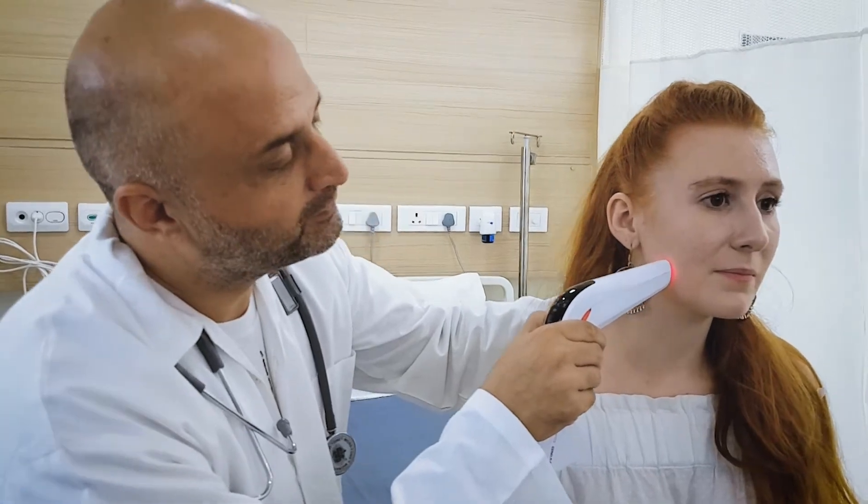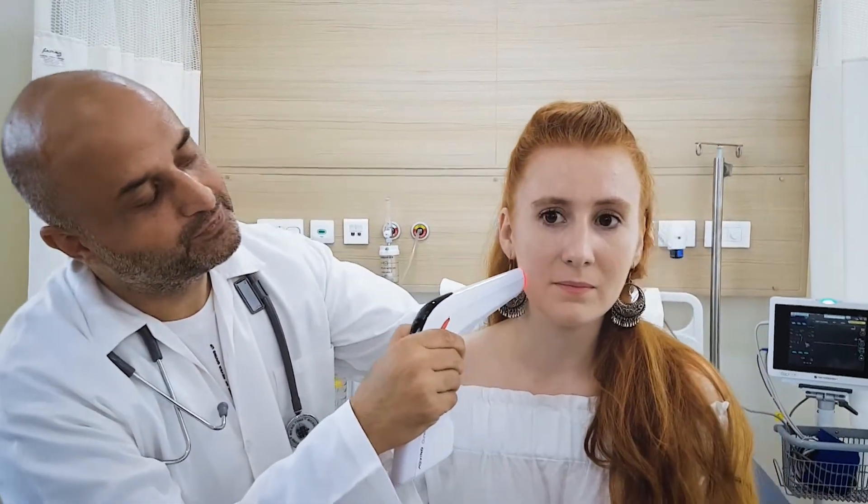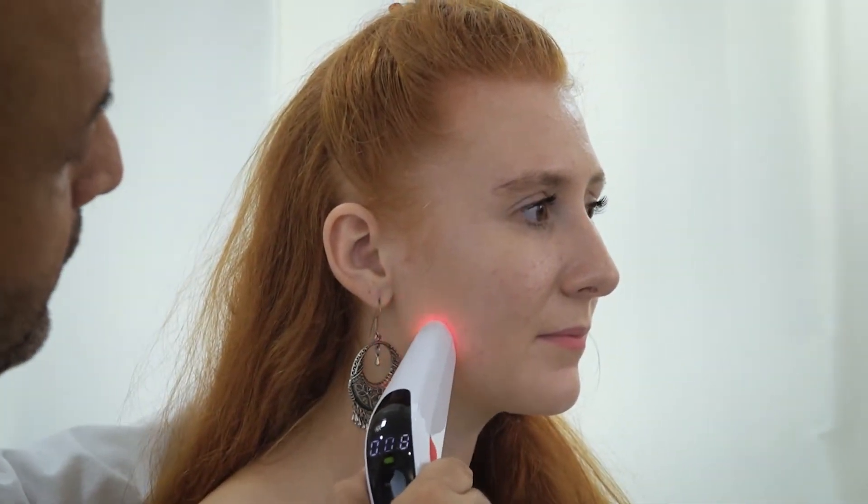Place the small therapeutic head in contact with the skin and slowly rotate the 360-degree wheel to activate the GT photonic cold laser and nanomolecular biostimulation.